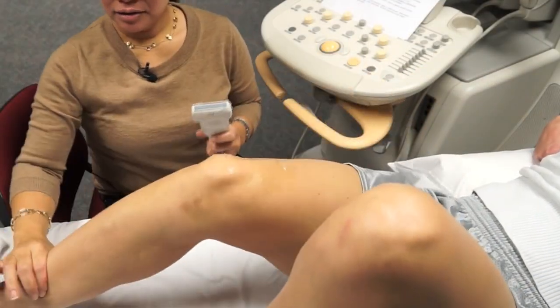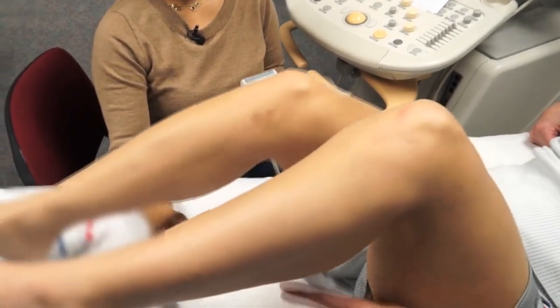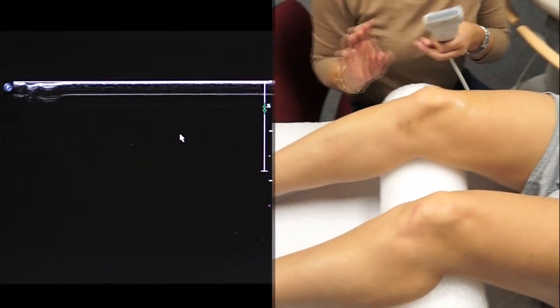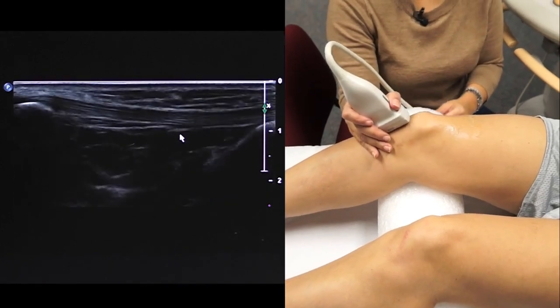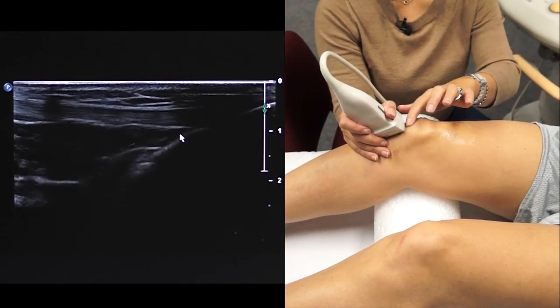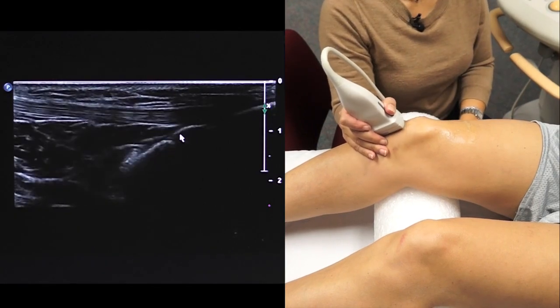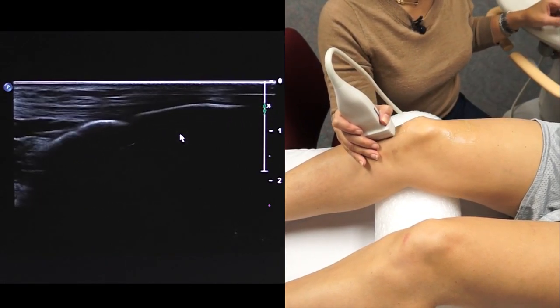Going back again, we're going to look at the patellar tendon. We can have the knee partially flexed, and you can slide the transducer along the inferior pole of the patella and look at the insertion of the patellar tendon onto the tibia.